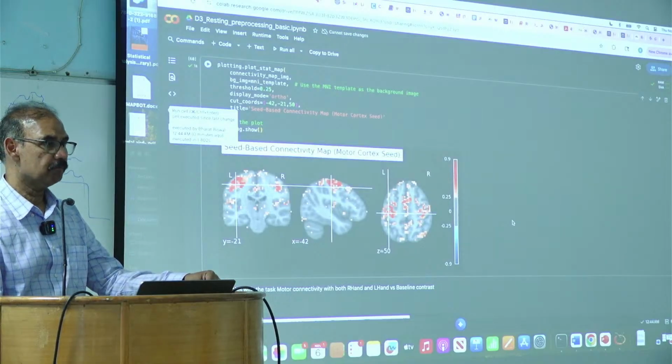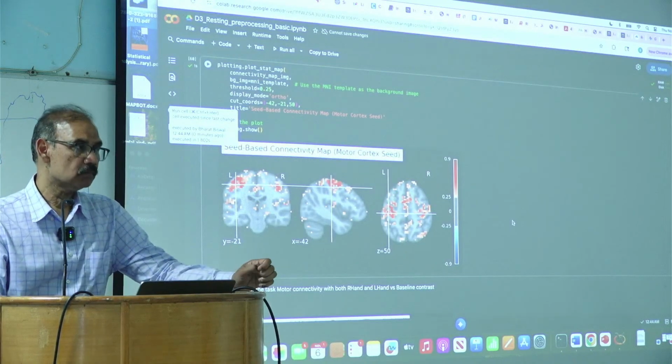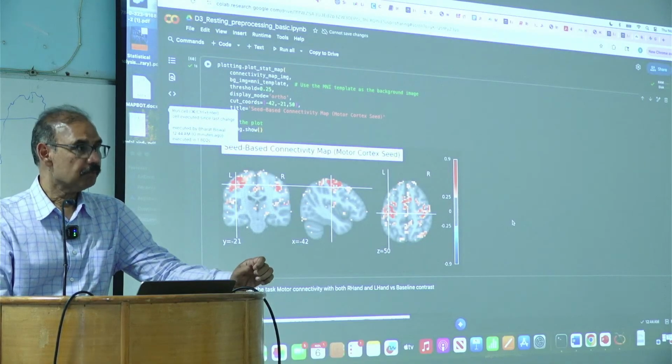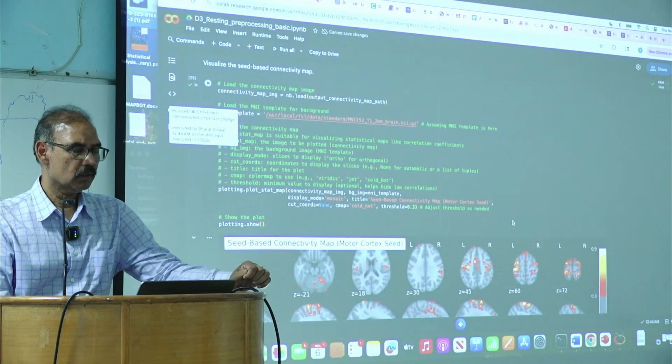So what I'm understanding is that the sphere is basically averaging out all the voxels within it, centered around that. Yeah. If I have a large sphere, I might end up including centimeter-scale objects also, which might bring out a different kind of weight.